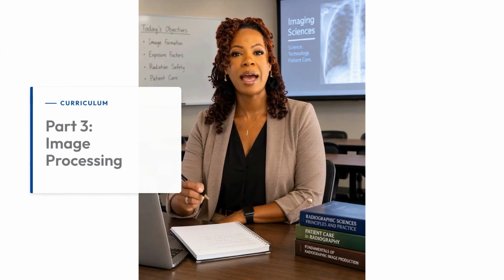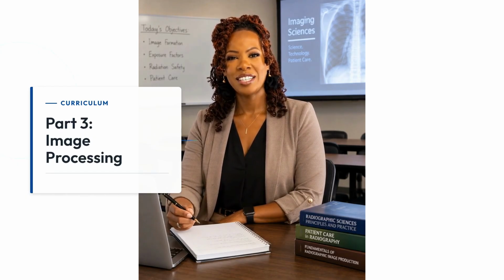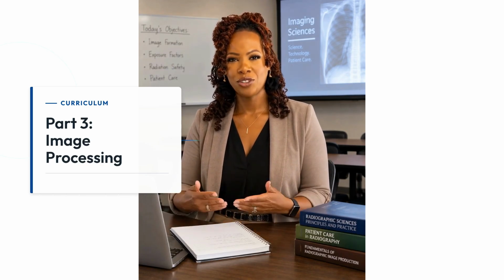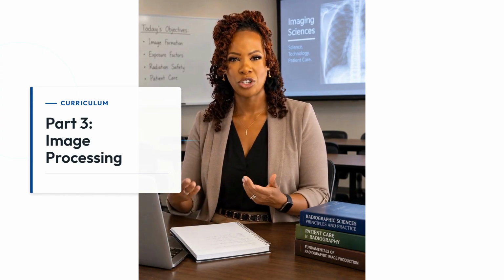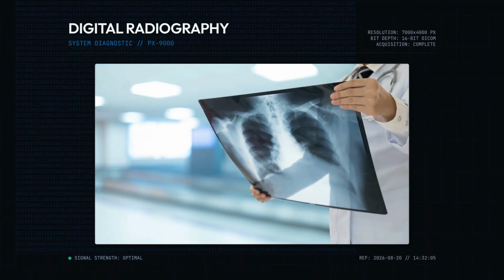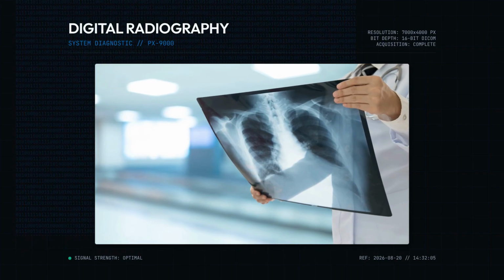Next is the processing stage. This is where the computer uses mathematical algorithms to prepare the image for human eyes. As the system prepares the image for display, it also performs histogram analysis, identifies the values of interest, applies automatic rescaling, and uses a lookup table to help determine the final grayscale presentation. These algorithms ensure the image has the correct contrast and brightness. These concepts are explained in detail in a separate Radiography Professor Explains video, so we will not cover them further here.